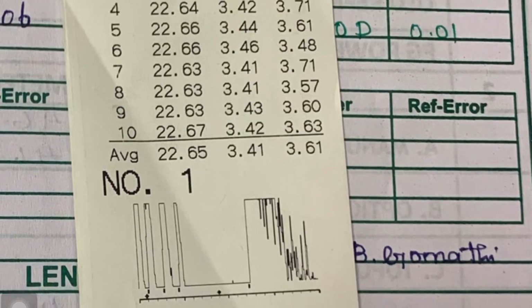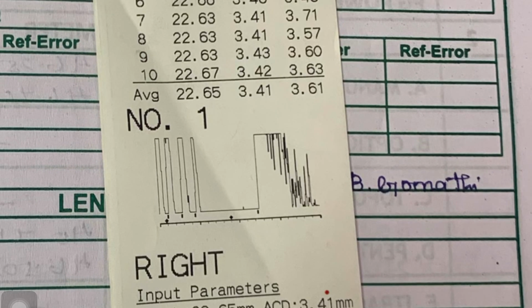All the echoes should be of adequate height. Here we have the corneal echo, the anterior lens echo and the posterior lens echo. The vitreous should be echo-free. If there are any echoes, then it needs to be correlated clinically.